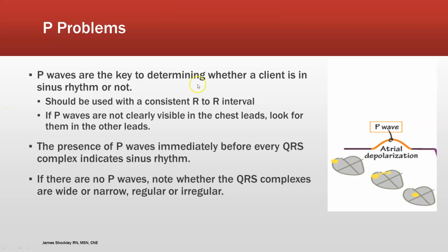So we've talked about what the P wave is. It represents atrial contraction. Generally speaking, if I'm going to have a dysrhythmia that's considered an atrial dysrhythmia, that is where the main issue will be. As far as the rhythms that are testable, we're going to talk about SVT, a supraventricular tachycardia.